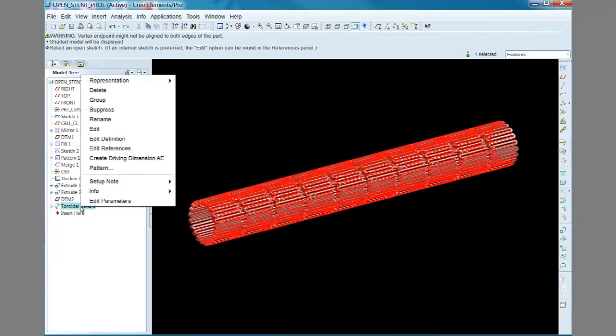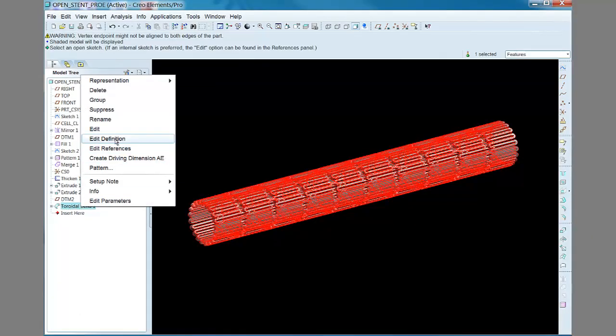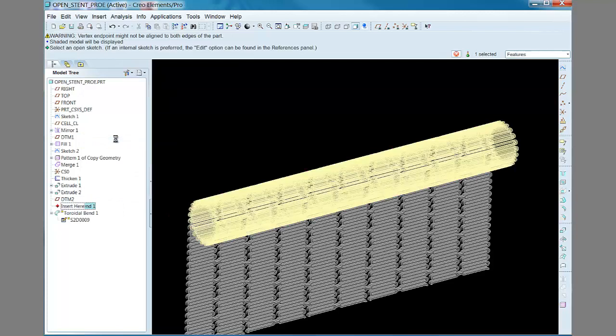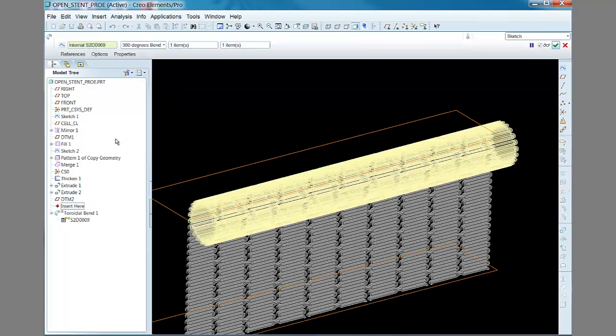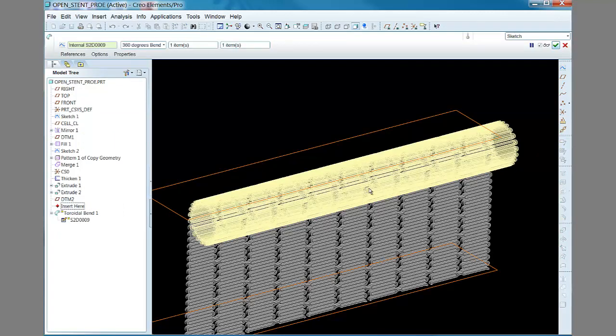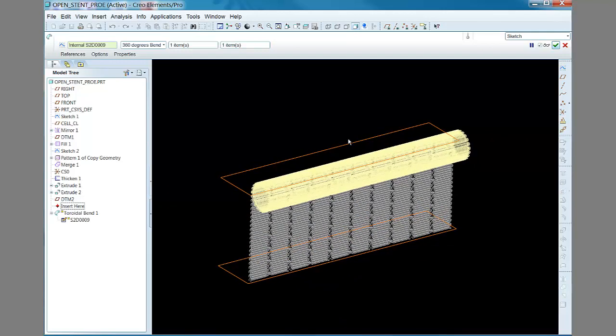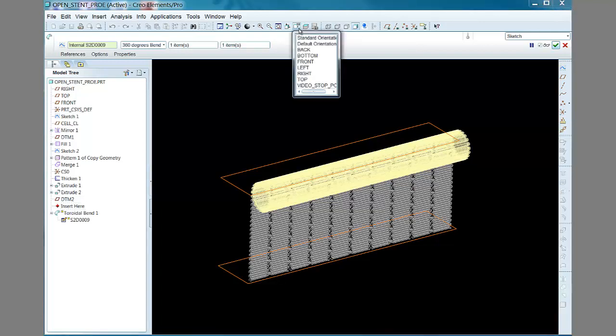Let's look at the toroidal bend feature in more detail using the edit definition function. Here we see the flat solid geometry being operated on, the two planes that act as the boundaries the solid is rolled between, and a preview of the toroidal bend in yellow.